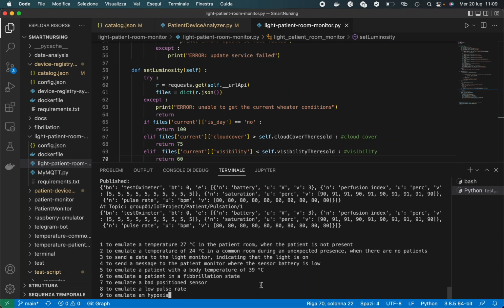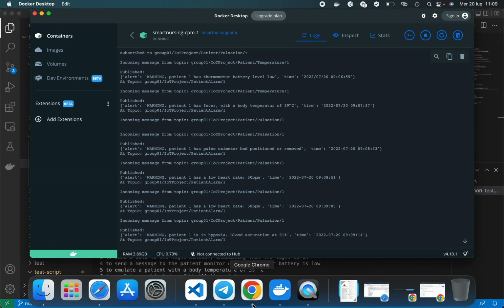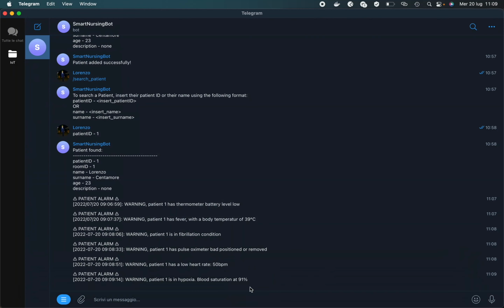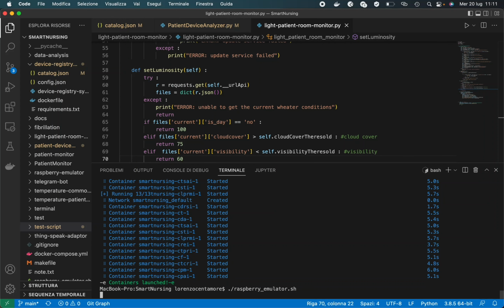To conclude, I emulate a case of hypoxia. The microservices detect it, analyzing the values of the saturation vector, and the alarm sends also the percentage of blood saturation. Until now, I used the data prepared expressly to generate events.